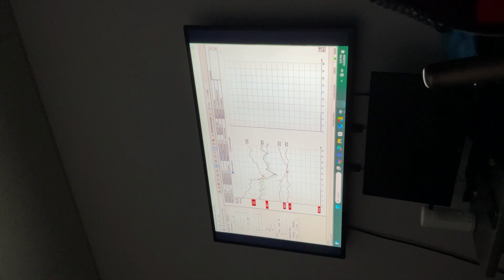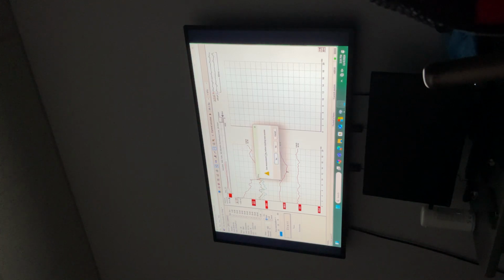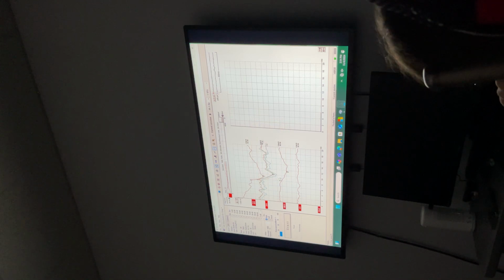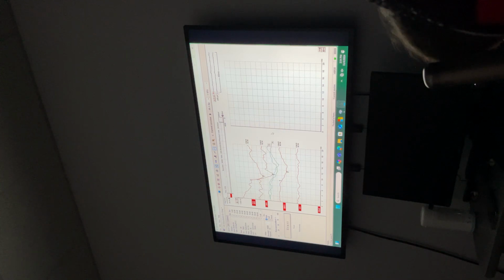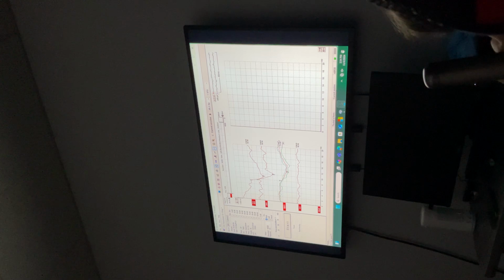I can hear it at 0. You can't? At 0, I could hear it. You could hear it, but we couldn't see it, so we couldn't measure it. So at 10, there is a response. So this was broadband, and 10 dB is the threshold. So that's not a response at 10? It's a response at 10. Yes, at 10. Not at 0 though. This is where it starts to get negative, but the problem is this is earlier than 20 and 30. I was looking at the normal peak, so you just mark it.